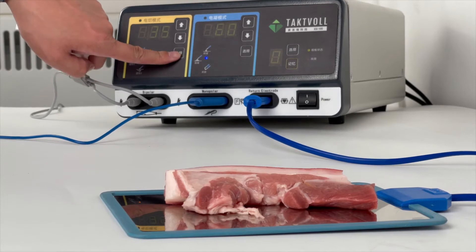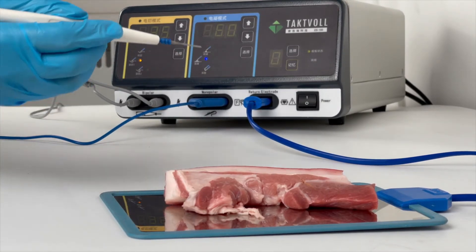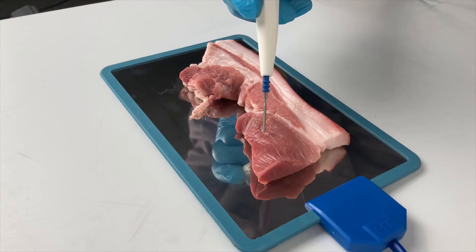Next, demonstrate the Blend 1 Mode. The power is still 35. Cutting under this mode provides a coagulation effect at the same time.